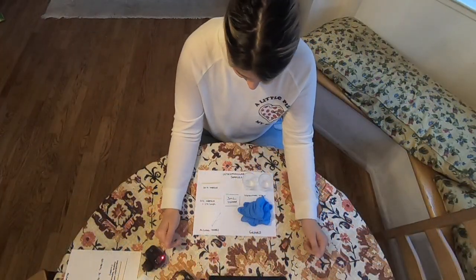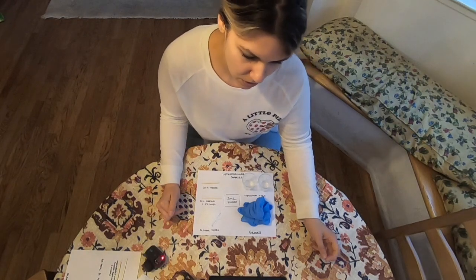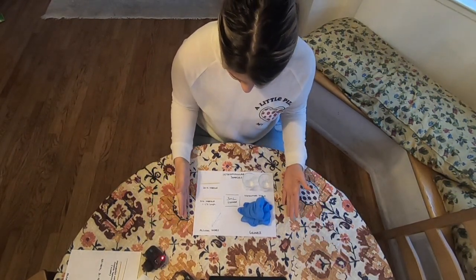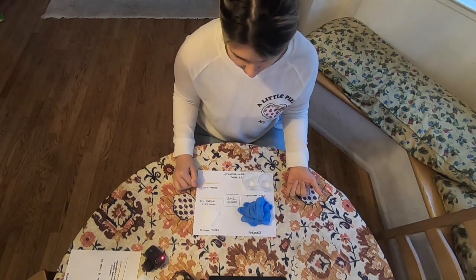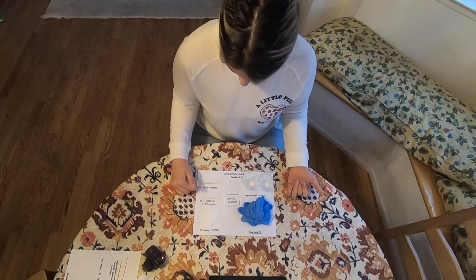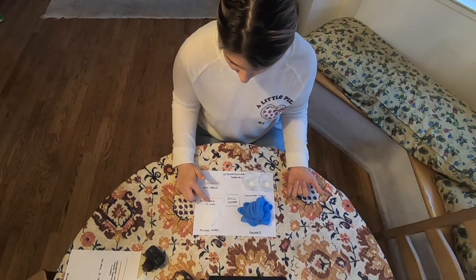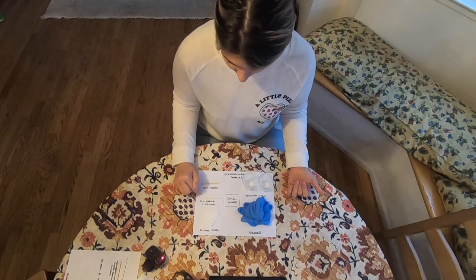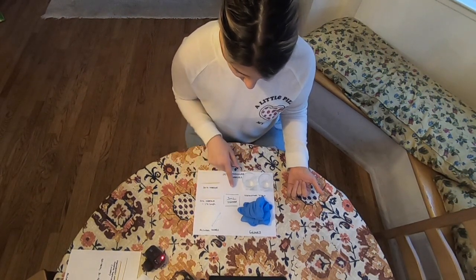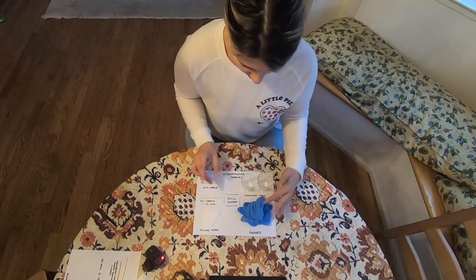Today we're going to do an intramuscular injection and reconstitute a powdered medication in a vial. Supplies needed are a 20 gauge needle to draw and mix the medication, a 21 gauge needle one to one and a half inches in length to administer, alcohol wipes, a 3ml syringe, two vials for medication, and gloves.